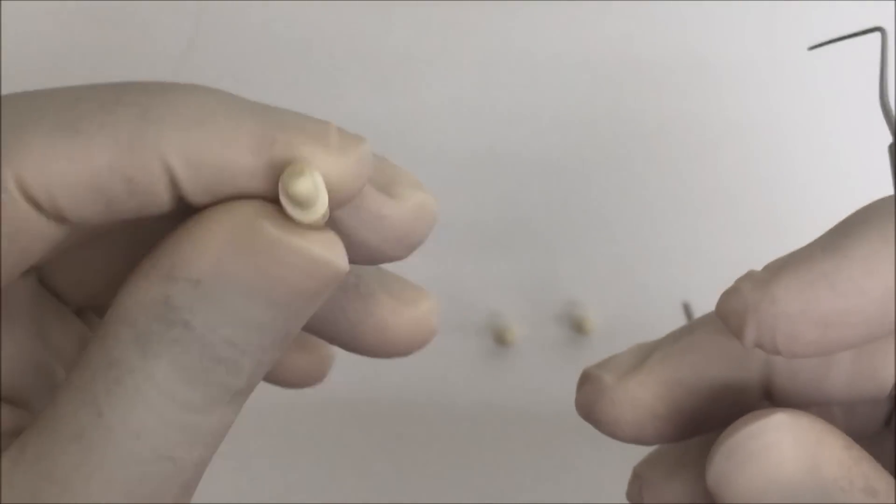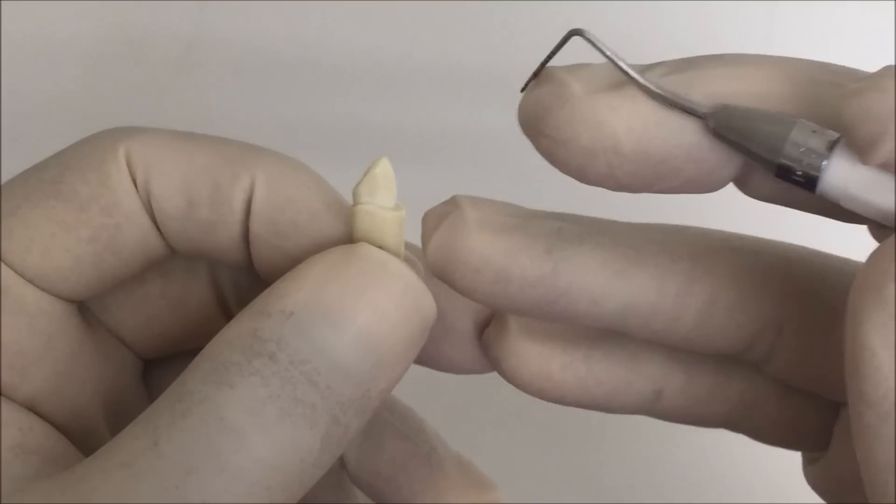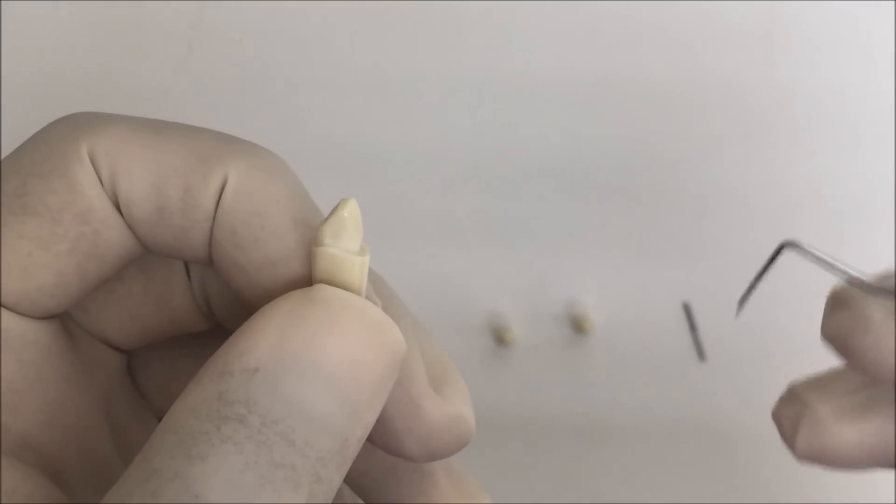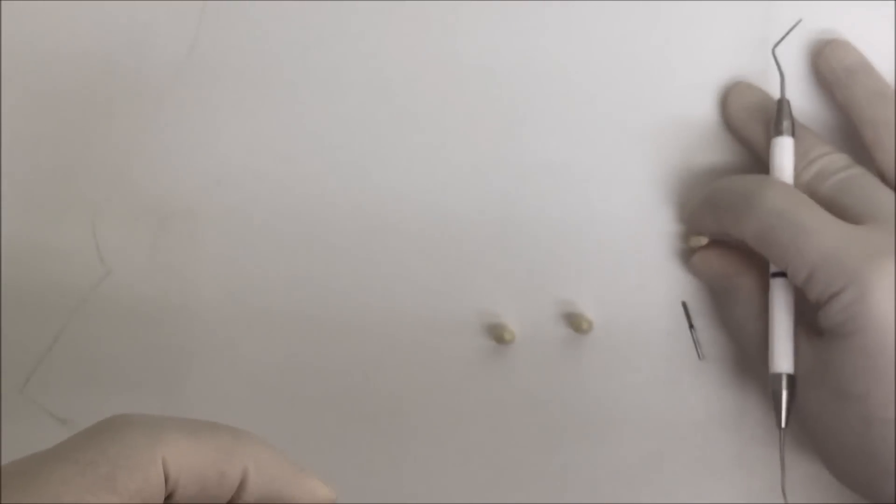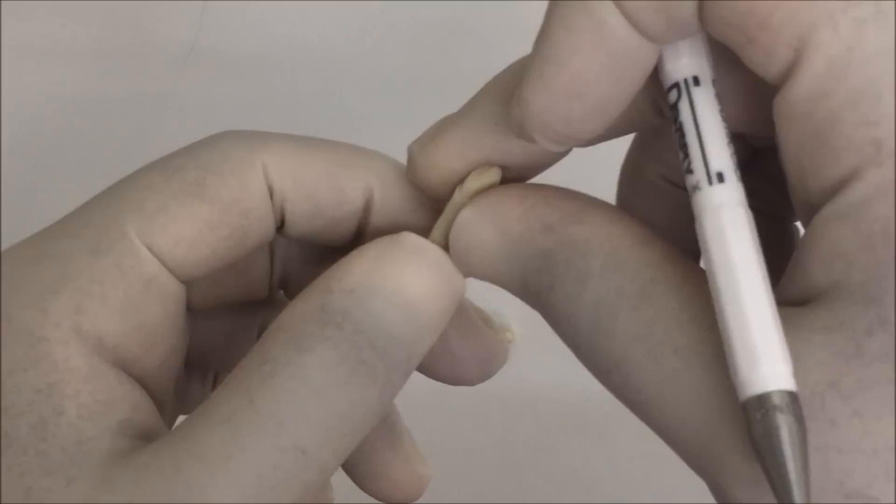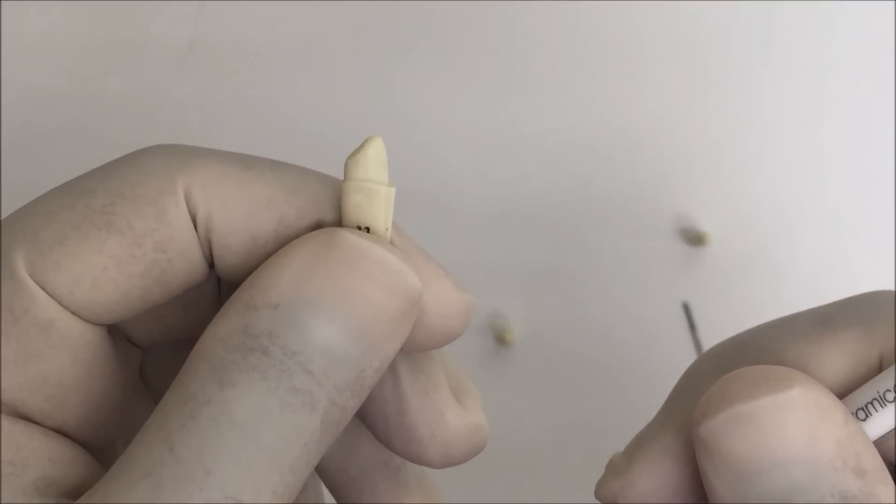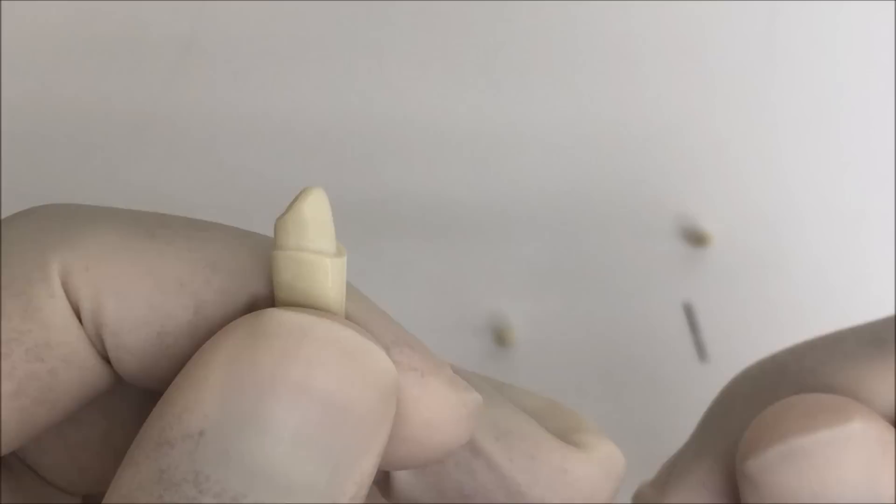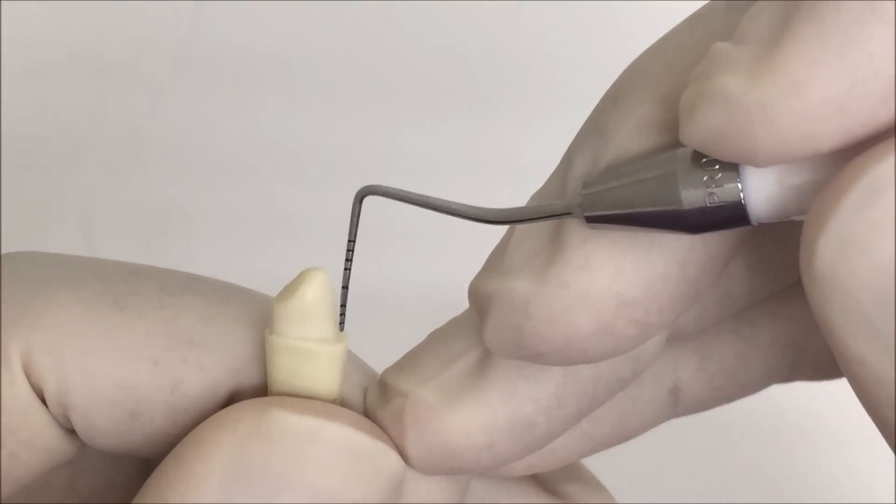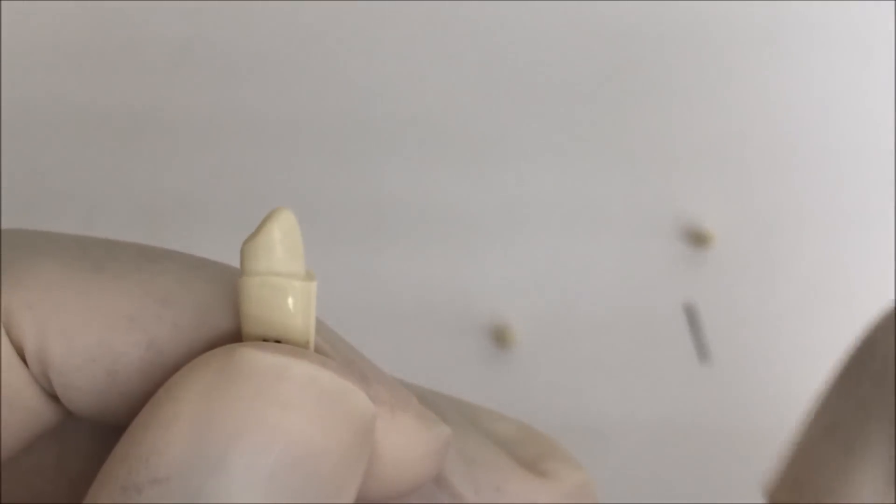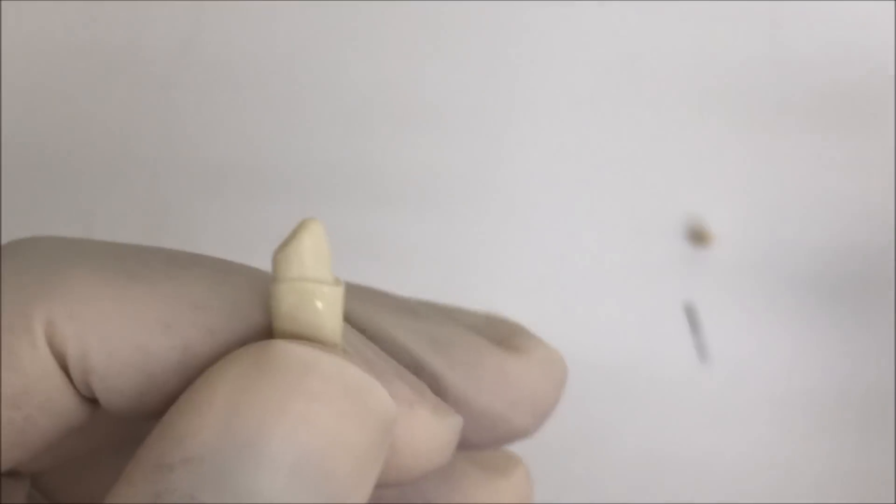As you can see here, this preparation has undercut labially, which I did for the purpose of this video. I will first show you a good preparation with good taper without undercut. When you check the profile of the tooth proximally, you can see it has no undercut here. This is the second method of checking.